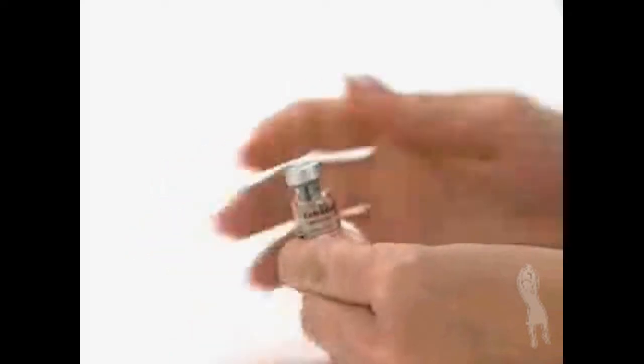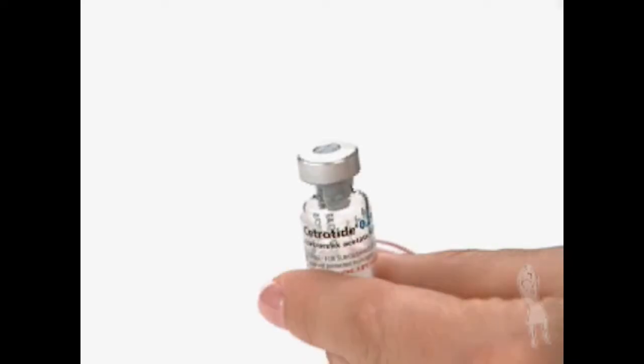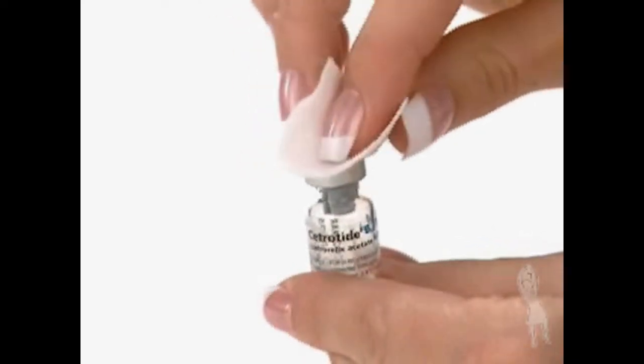Wash your hands with soap and water. Using your thumb, flip off the protective plastic cap on the Cetrotide vial. Wipe the top of the vial with an alcohol swab.